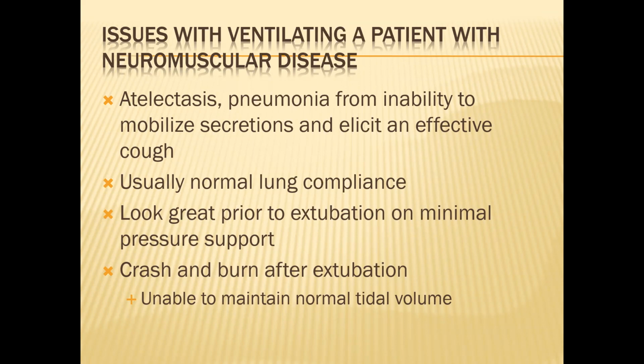So when you have them on minimal pressure support, like 5 of pressure support, looks like, yeah, you could extubate, they're going to do fine. You extubate, you take away that little bit of pressure support, and they can't maintain their tidal volume. So they could look great, you extubate, and then they don't do well. Question? Before you do your parameters, check and see if they're ready to get extubated, they'll still do well on those too.